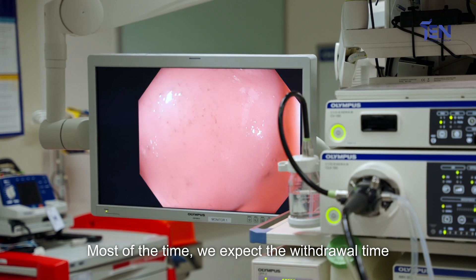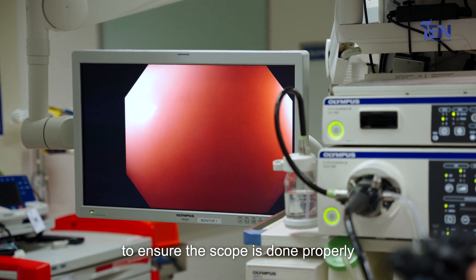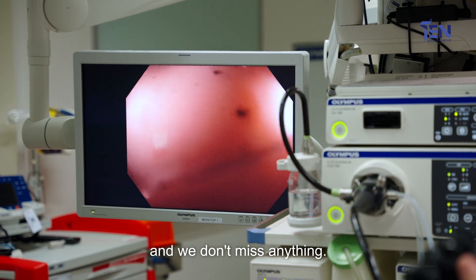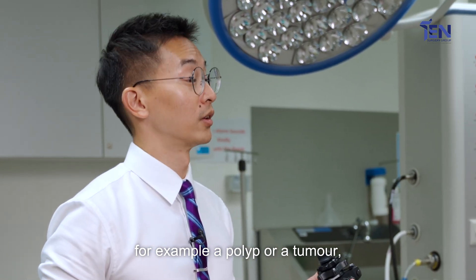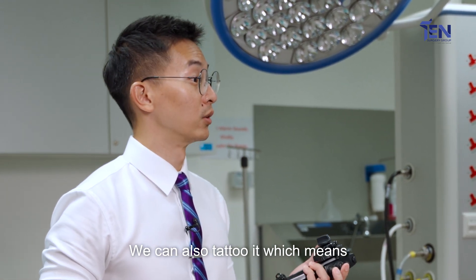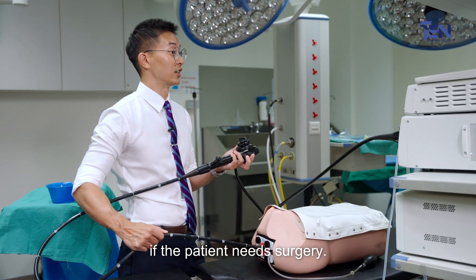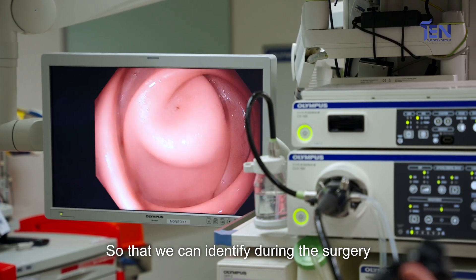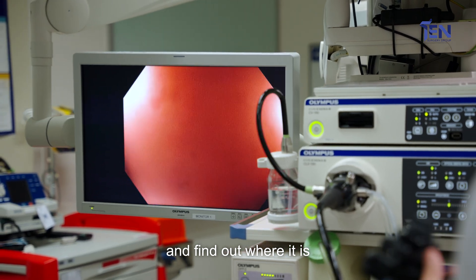Most of the time, we expect a withdrawal time of at least six minutes to ensure that the scope is done properly and we don't miss anything. And of course, if we see something — for example, a polyp or a tumour — we can remove it or take a biopsy. We can also tattoo it, which means put a mark on it if the patient needs surgery, so that we can identify during the surgery where it is and remove it from there.